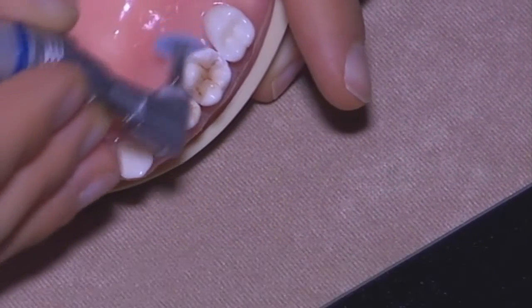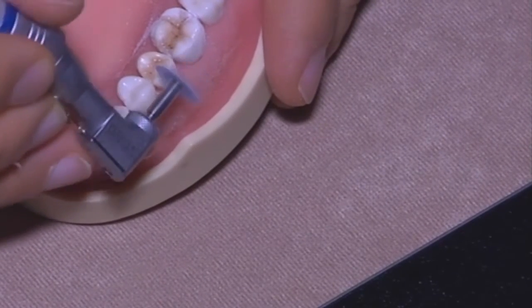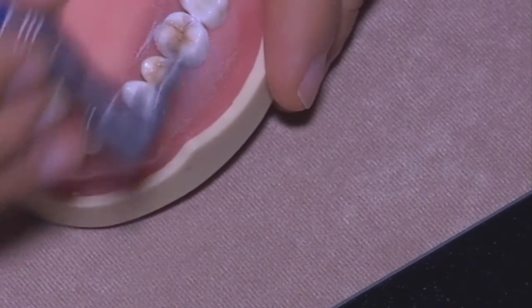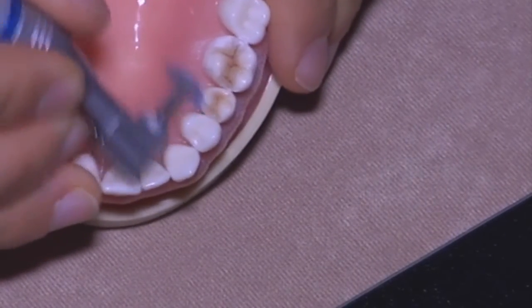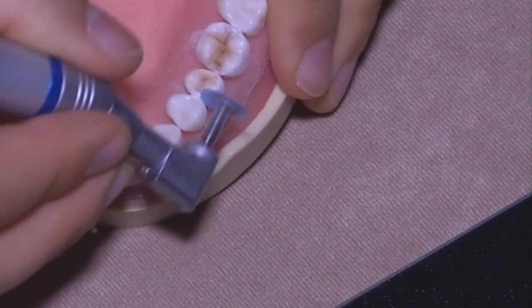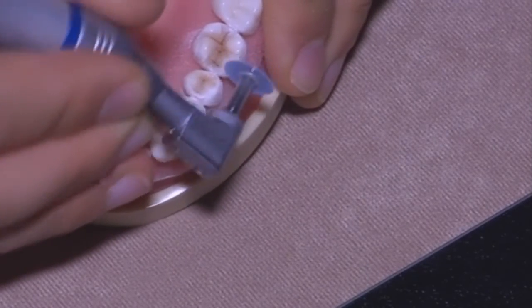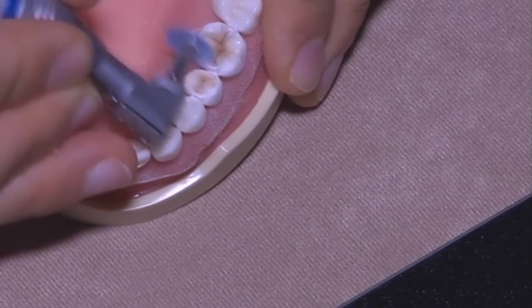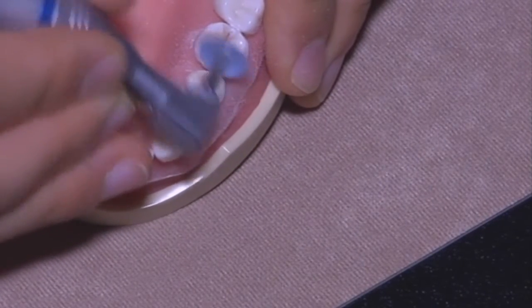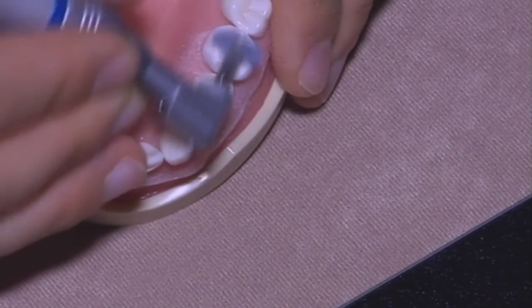Even because in this area you always have excess not only of composite but also of adhesive. Of course, this one goes only around the contact point, not inside the contact point.